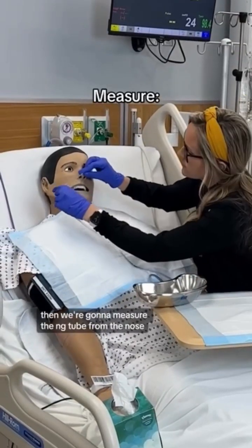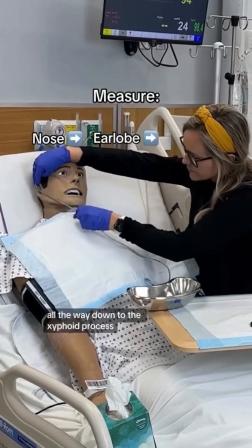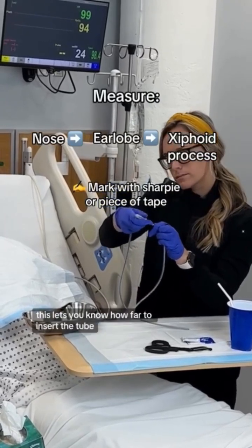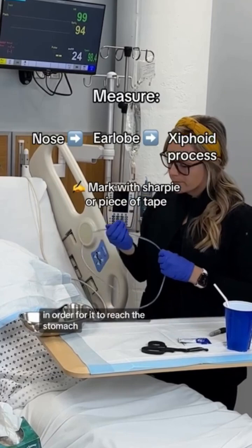Then we're going to measure the NG tube from the nose, bringing it to the earlobe all the way down to the xiphoid process. Then you want to mark this with a sharpie or a piece of tape. This lets you know how far to insert the tube in order for it to reach the stomach.